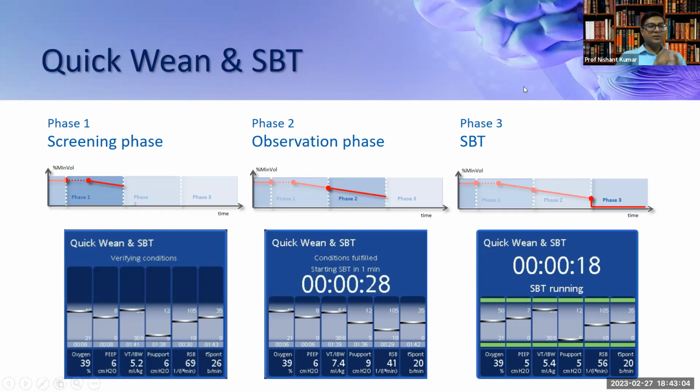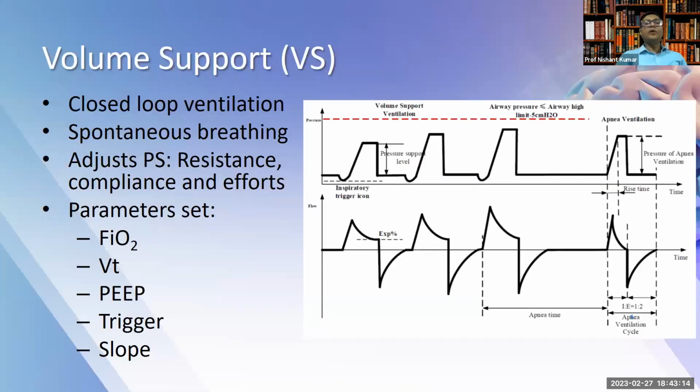Please remember, this is not a substitute where you put the patient on the ventilator and forget it, and the ventilator will do the work for you. You'll still have to monitor the ventilator. Okay, so these were the modes where you can use both the control modes as well as the spontaneous modes, or a combination of the two.